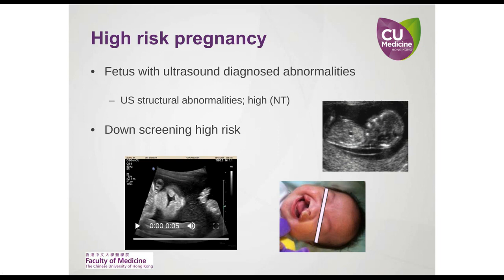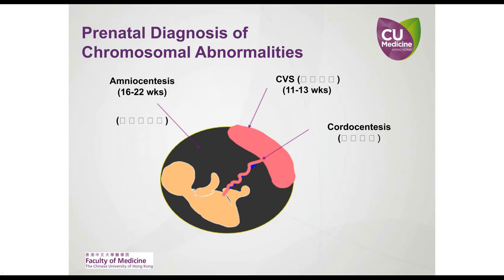And we are able to get very precious samples either by amniocentesis, by CVS, or even by cordocentesis. So with that, there's a need to diagnose lots of different types of disorders, not just common numerical disorders. That's why microarray is able to help pick up the pathogenic copy number variants.